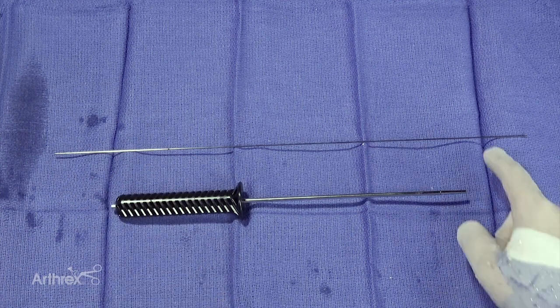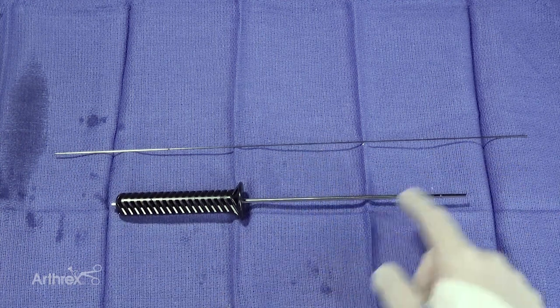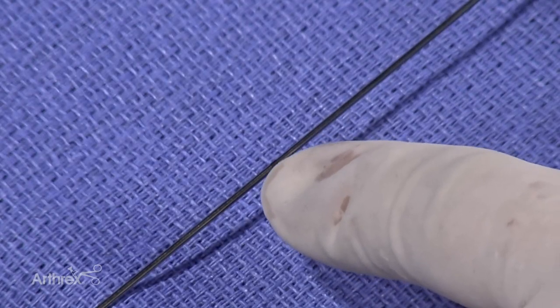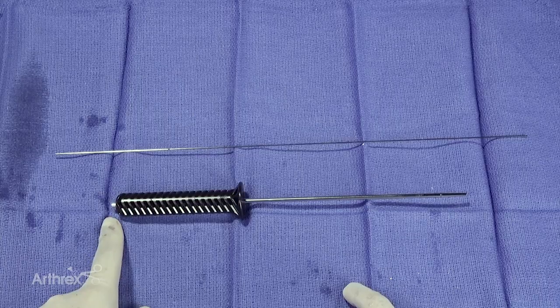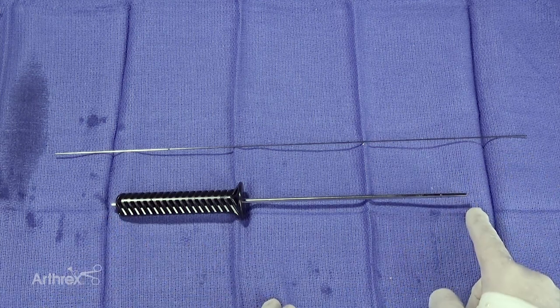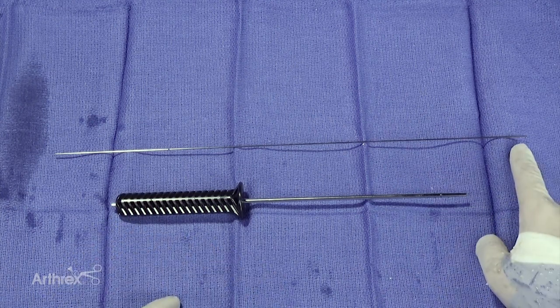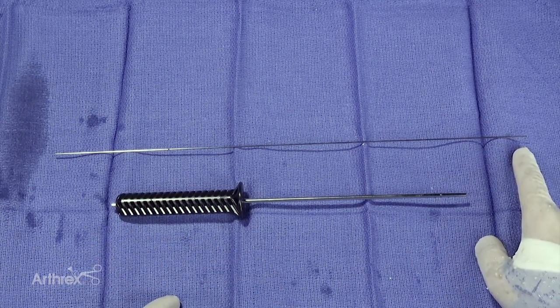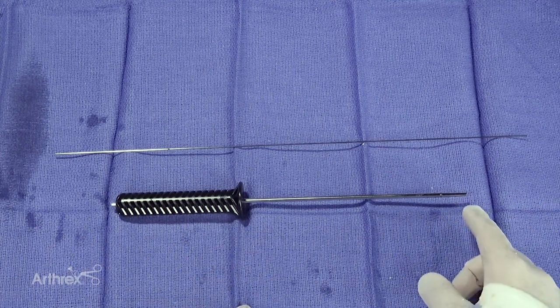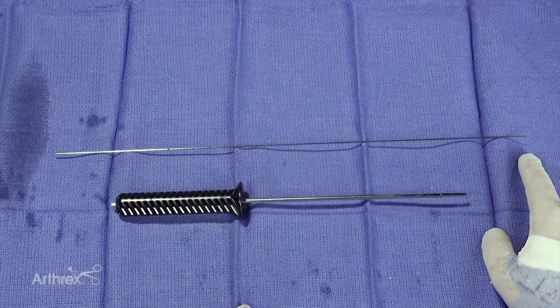Your trocar tip wire will go through your dilator so it remains collinear. There's a mark at the back of the pin — that mark will be flush with the back of your driver when the pin is a centimeter beyond the tip of your dilator. This ensures the trocar tip of the wire is engaged in the bone about a centimeter distal to your dilator, so the pin will maintain its position.